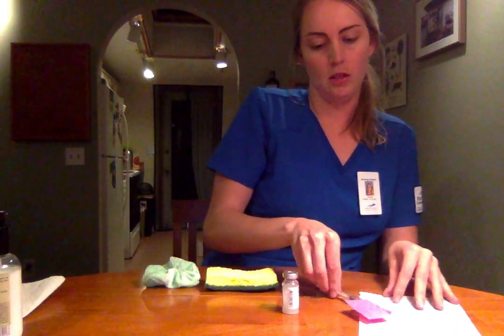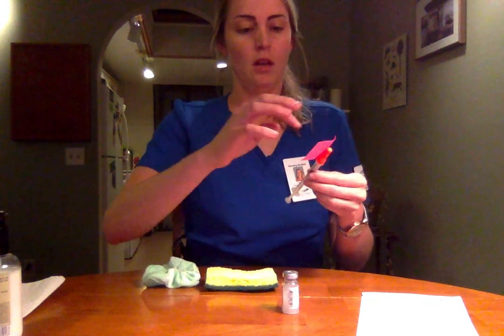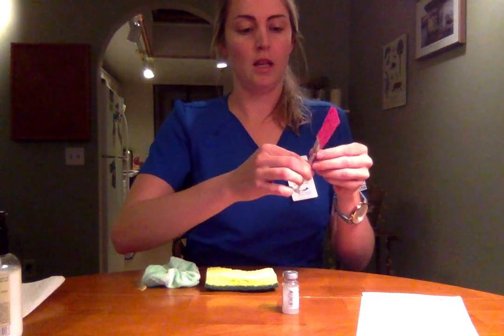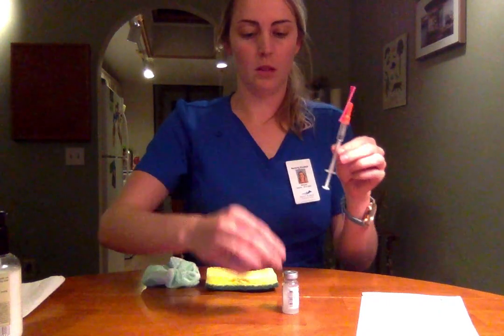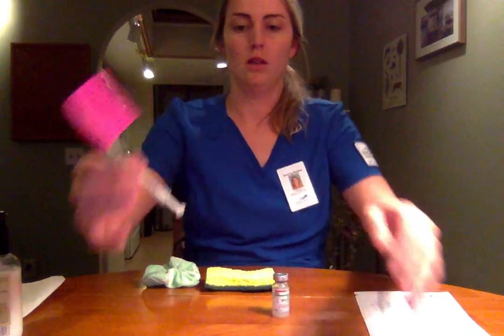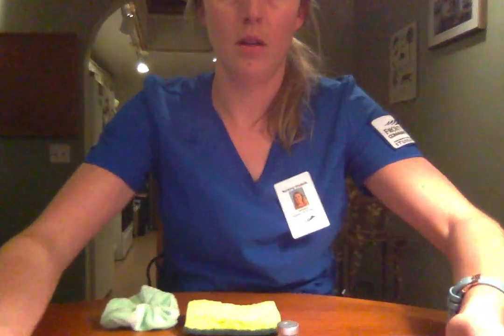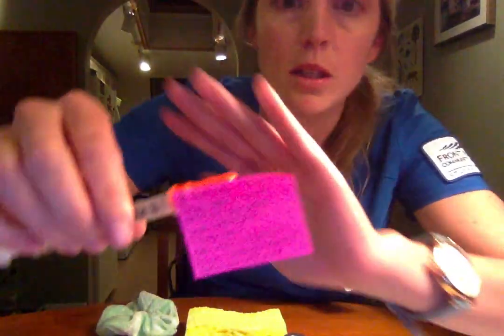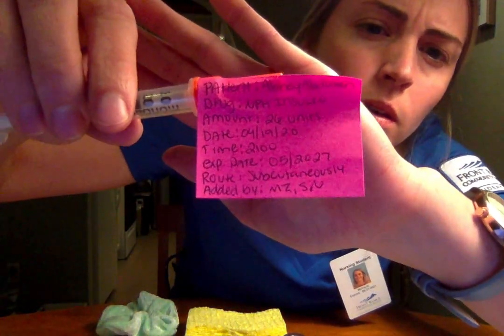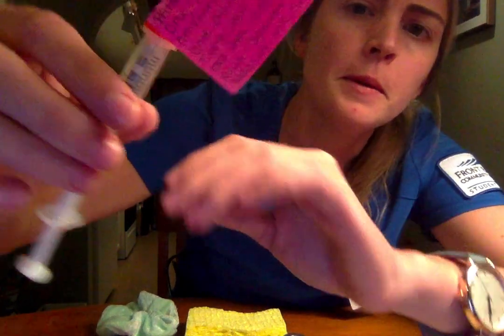Now I'm going to show the instructor my syringe here with the label and the correct amount with no bubbles, and my vial here. Okay, I'm just going to move this forward because it will be easier to see. Okay, so there is my label.